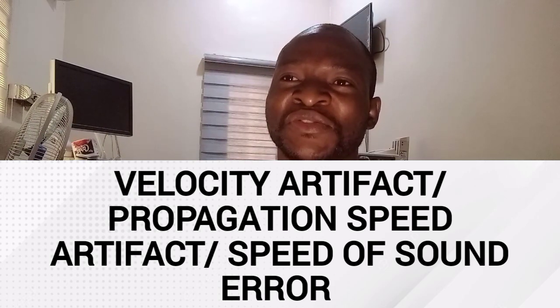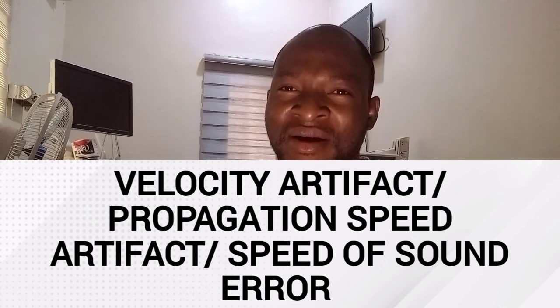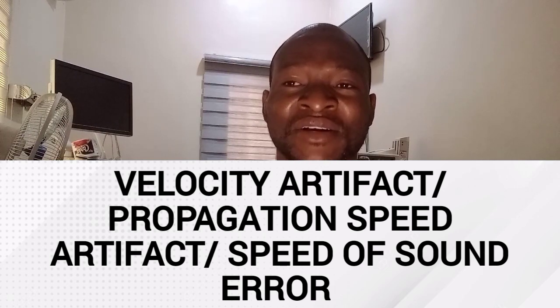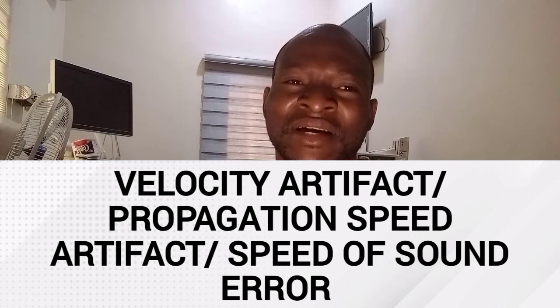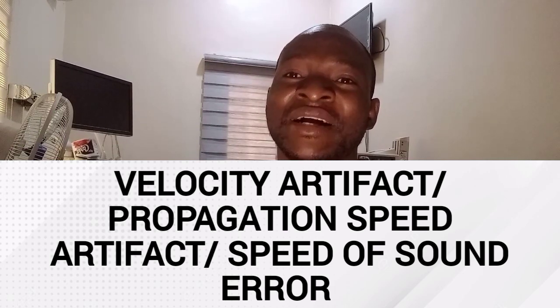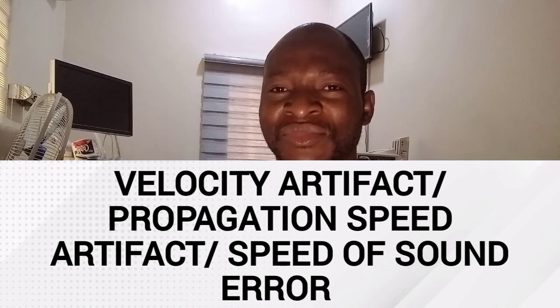Now, the most common cause for velocity artifact is a fat mass, like a lipoma. The speed of sound in fat is 1.44 millimeters per microsecond, which is approximately 6% slower than the speed of sound in soft tissue. So sound traveling through a fatty mass will take 6% longer to return to the transducer than through normal tissue.